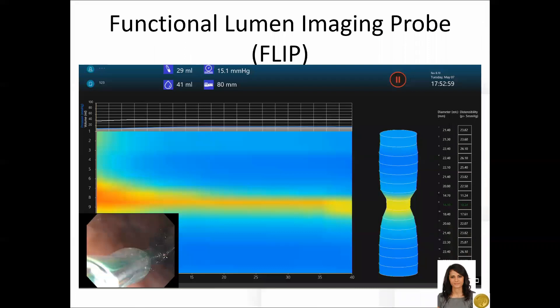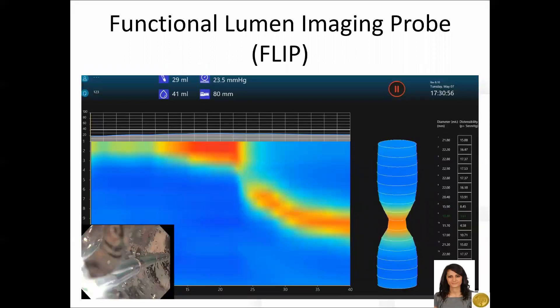For ease of catheter placement and manipulation, we opted to predominantly use this technique. A 240 centimeter catheter with an eight centimeter long balloon was used in all cases. The FLIP balloon was stabilized and inflated to a fixed volume of 40 cc's in all cases, which has been shown to be the optimal volume for evaluating pyloric sphincter contour. After waiting at this fixed volume for 30 seconds, the mean cross-sectional area, diameter, and distensibility were measured at the narrowest part of the pylorus as represented on the topographic map.